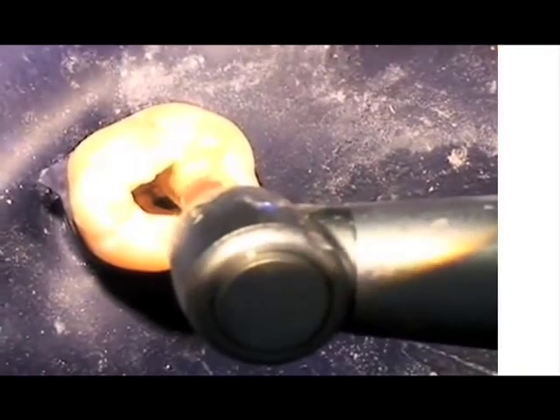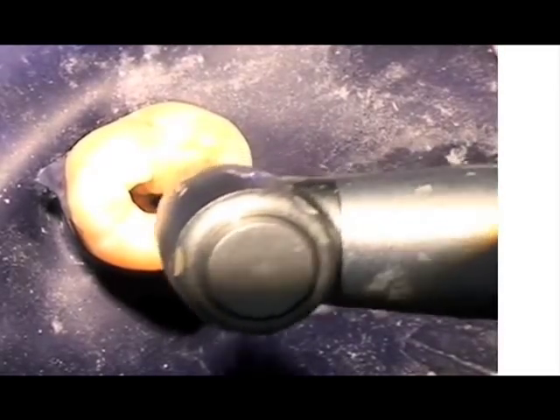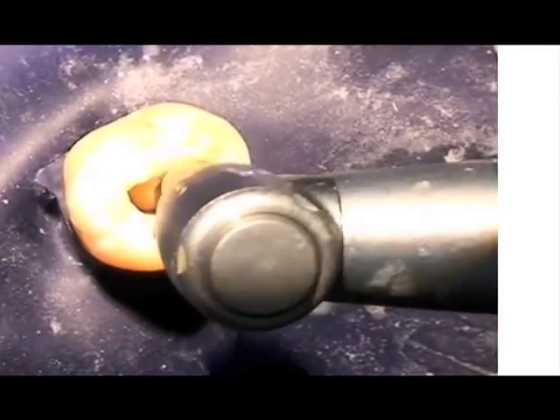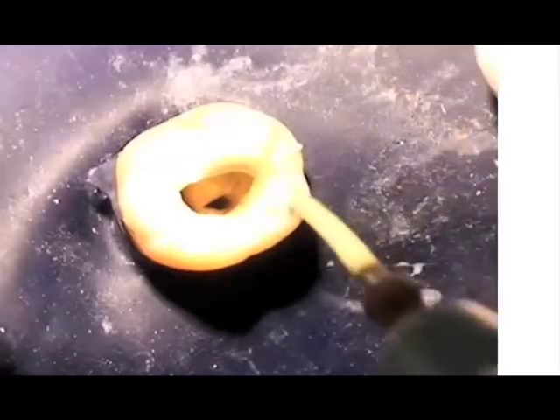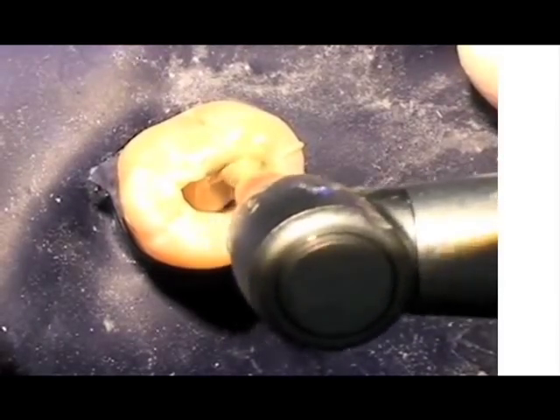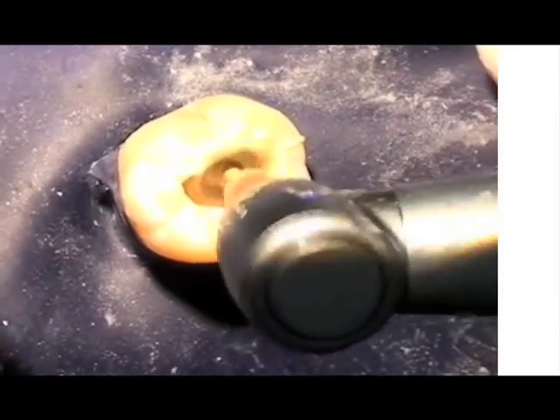The cement action occurs when the cement is placed into the canals. The spiral is fully loaded and introduced three millimeters short of length. Several up and down strokes are used as it rotates clockwise. Each canal gets two full loads of cement, each applied with six to seven vertical strokes.